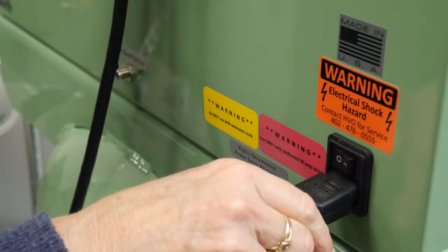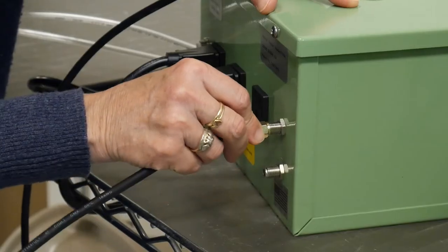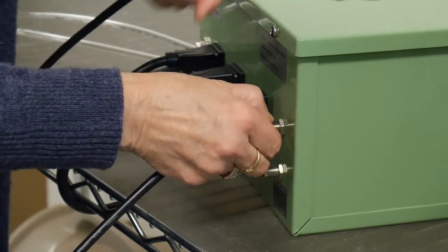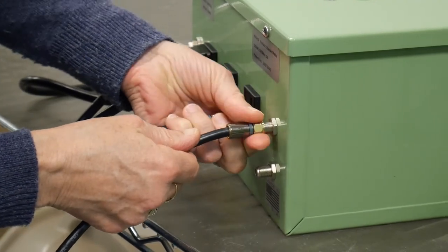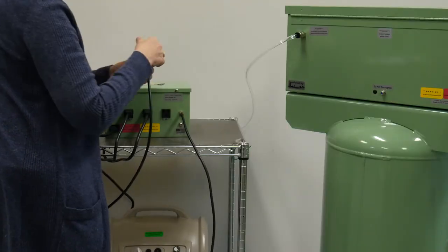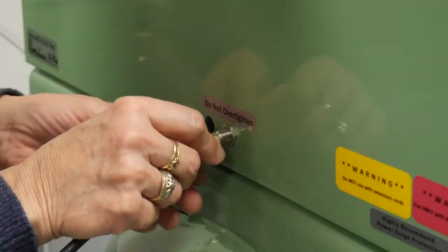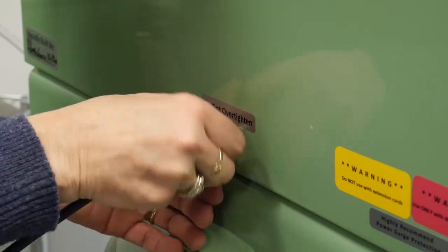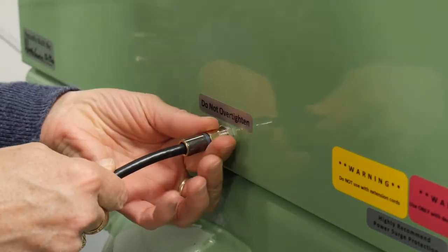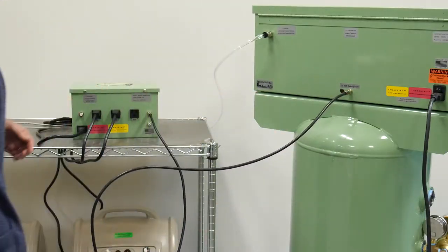Attach the machine cord to the back of the HVO system. Attach the coaxial cable to the relay box by threading on to either coaxial connector. Make sure the connection is secure and hand-tightened only. Over-tightening with a tool can damage the connections. Attach the other end of the coaxial cable to the rear of the HVO system by screwing on to the threaded coaxial connector. Again, hand-tighten only.